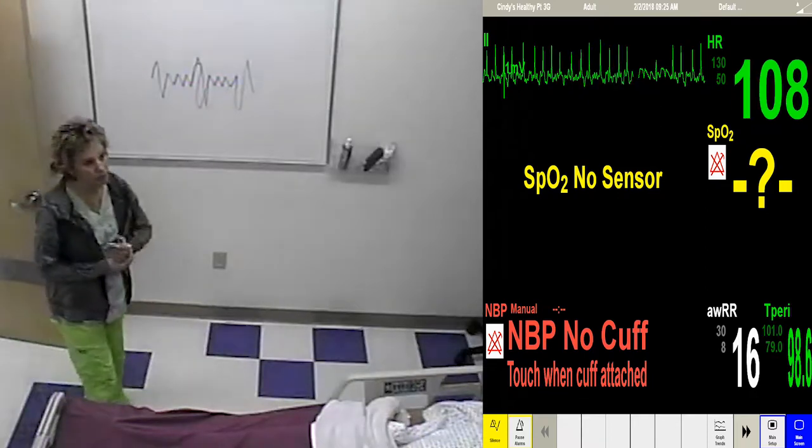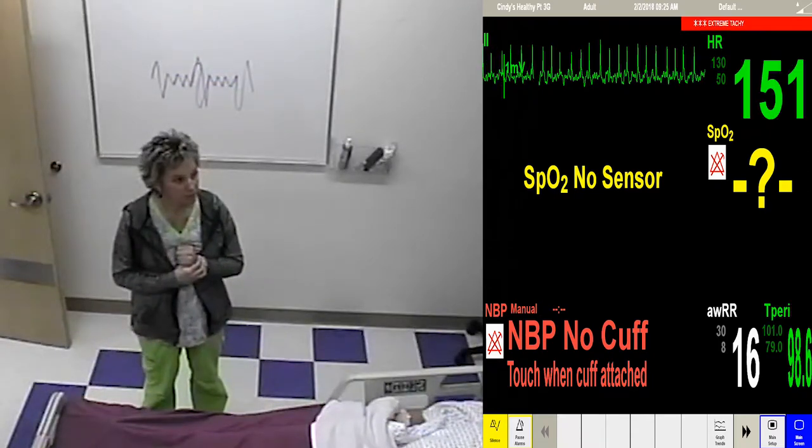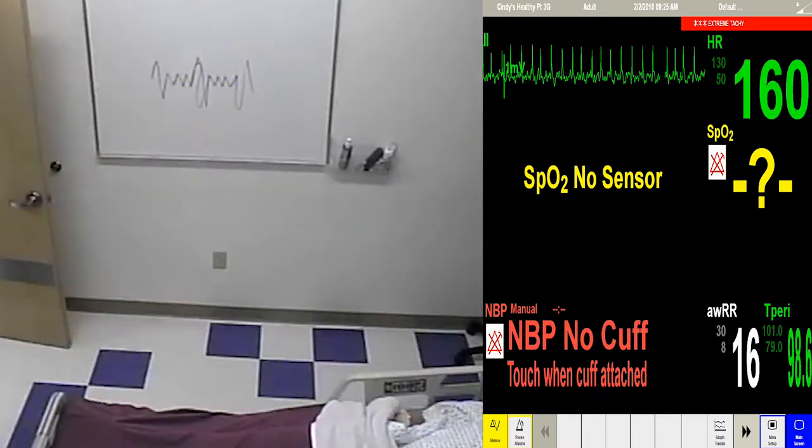I would come over and, are there P waves? I'm not sure. Here, let me do something. Let me turn off this alarm so it's not obnoxious.